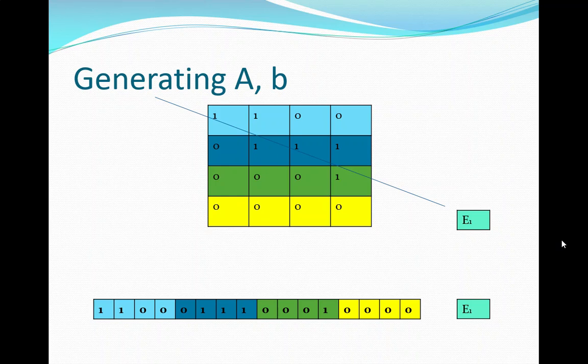Imagine that's your volume area, and it's just a 4x4 because rather than drawing hundreds by hundreds, that's a pain to draw. 4x4 still works. We turn it into a vector by just chopping up the box. This one is row-wise. You could also chop it up column-wise. That's a convention, you just have to ask what people do. On ours, we do row-wise.